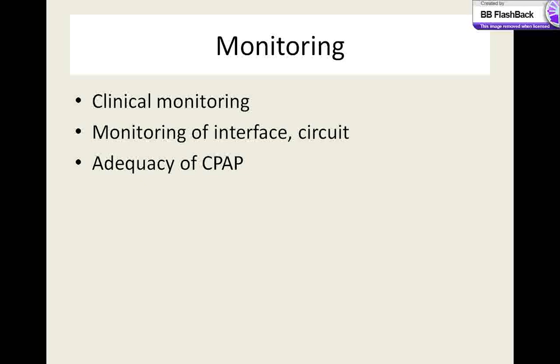Success of CPAP very much depends on achieving desired pressure of CPAP and then subsequently maintaining that level of pressure. Clinical monitoring of the patient, the interface, and the circuit is important in maintaining CPAP at desired level.